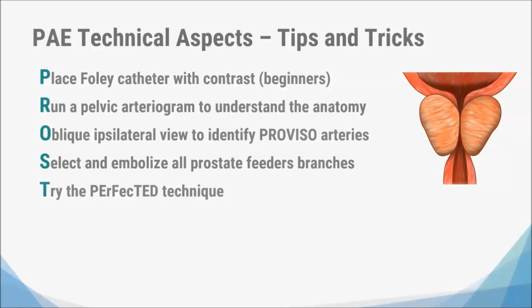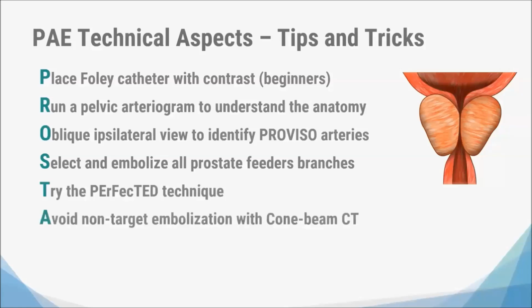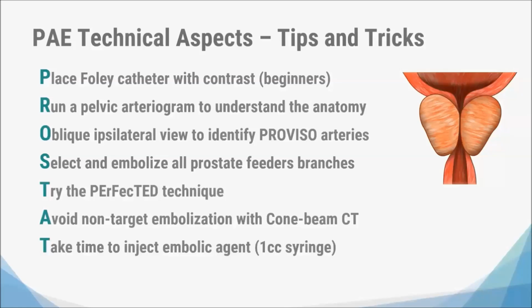Try to do the PErFectED technique, because once we compared it to the original, we have seen that PErFectED is much better than the original. Avoid non-target embolization using cone-beam CT, mainly if you have cone-beam CT, and of course using simulators. And take time to inject embolic agents.